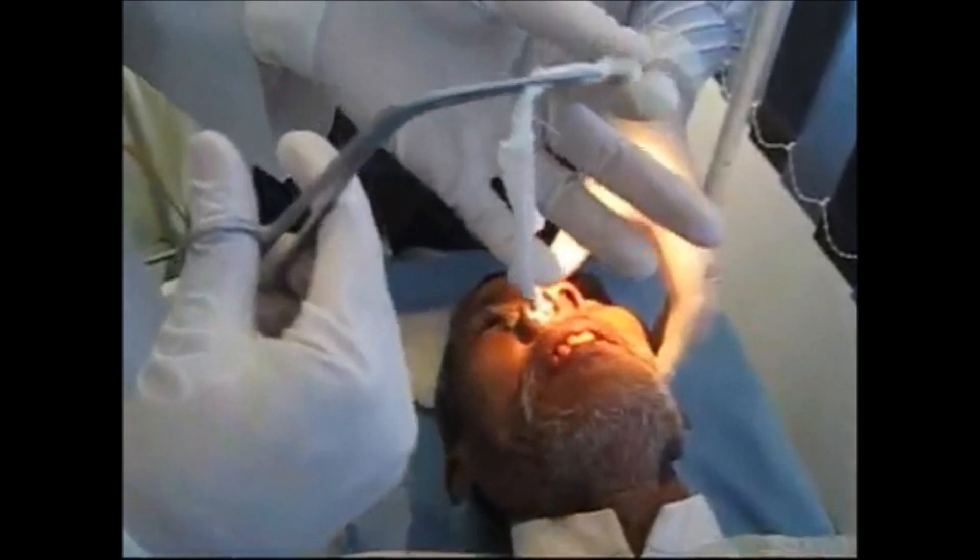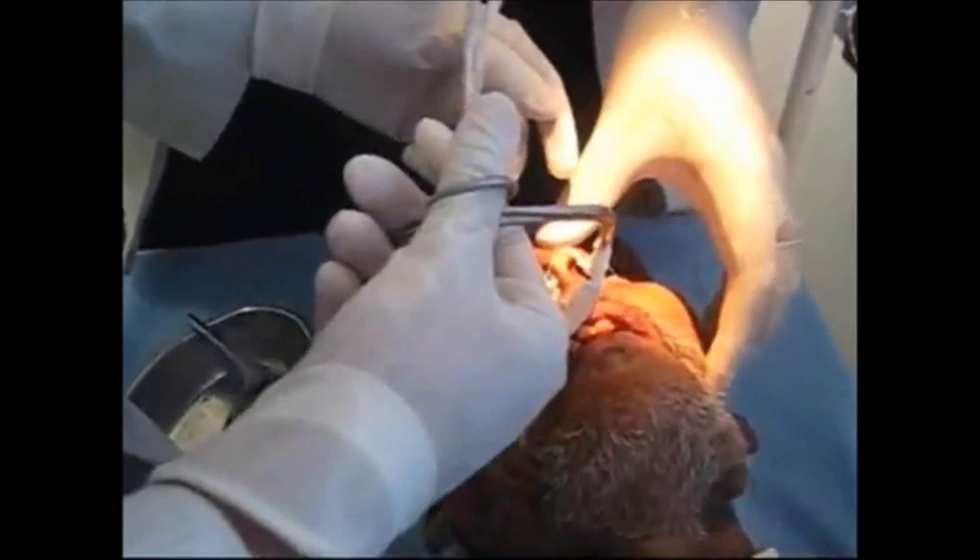Packing can be applied for 24 hours, and if there is no bleeding you can also keep it for more hours — for 48 hours or 72 hours.